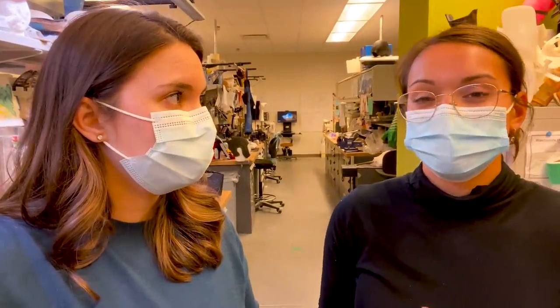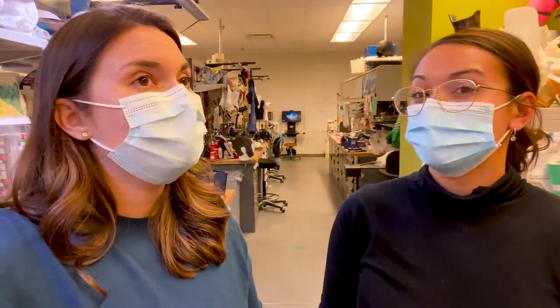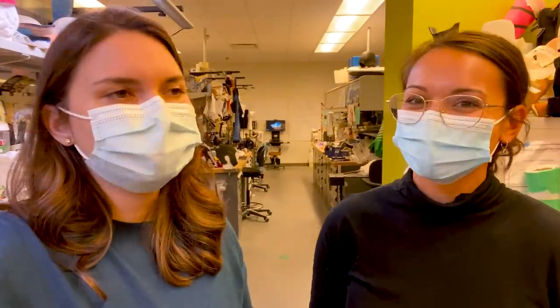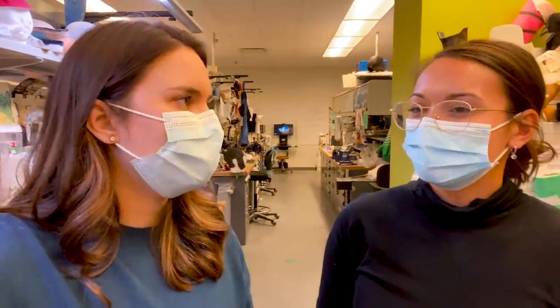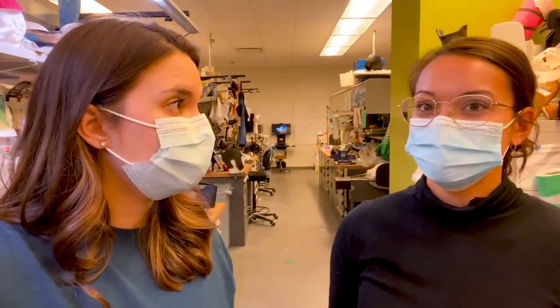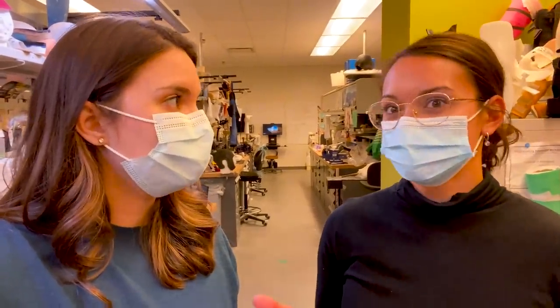Another thing about myoelectric devices is they can be quite expensive, and they're not very durable, so you can't use them in things like water, and there are more moving parts that are susceptible to breaking. Okay, that makes a lot of sense. Fair enough. So in specific scenarios, absolutely, they can be really helpful, but not everything. We like to think of prosthetics as a tool to help aid you in your independence. And so sometimes the best tool is a myoelectric device, but not all the time.